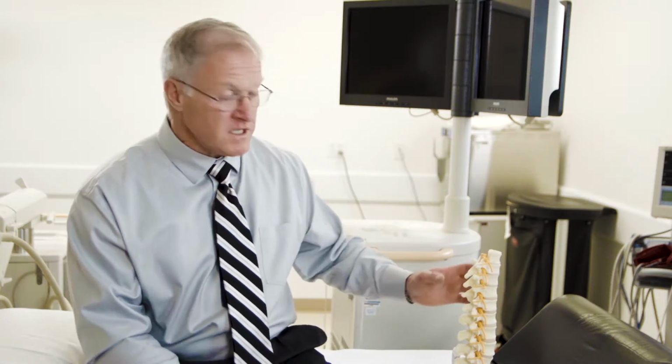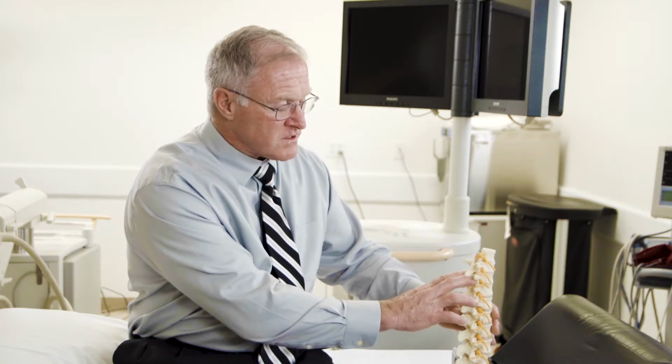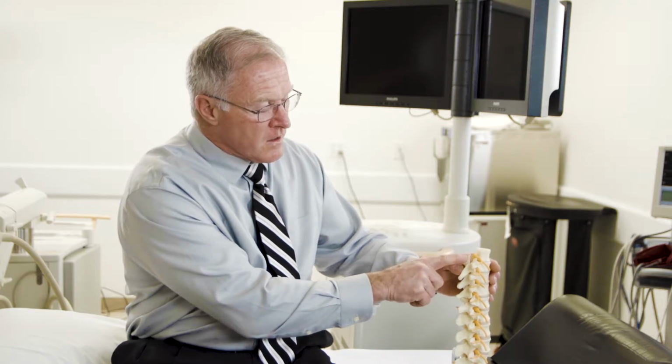And we will advance, under fluoroscopic guidance, those leads right to a certain area, typically in the thoracic spine. So we'll enter the spine low, we'll advance it into the thoracic spine, and then we'll place those little leads into the space outside of the spinal cord, but inside the actual spinal canal.